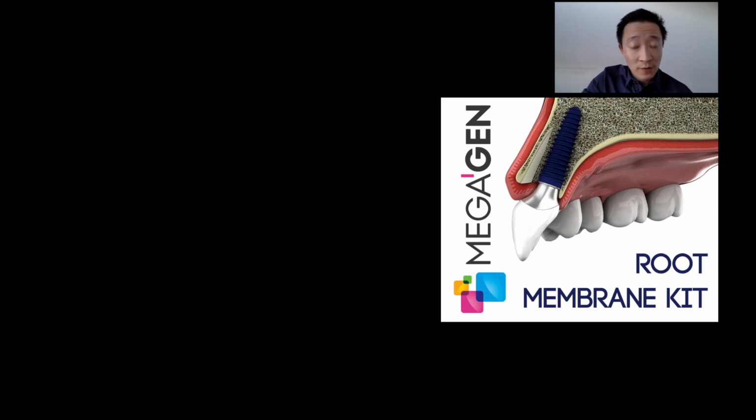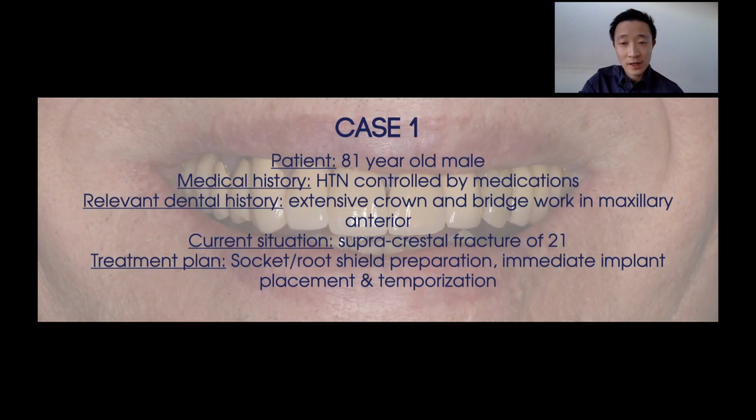So I know many of you probably already practiced this treatment, but for those that have not tried it yet and are curious, I highly recommend you do this, because the two cases I'm showing today are two of the first ones I had done with this technique and with this kit, and as you'll see, the results are very good so far. So the first case is an analog case.